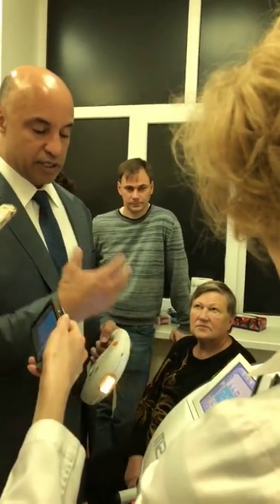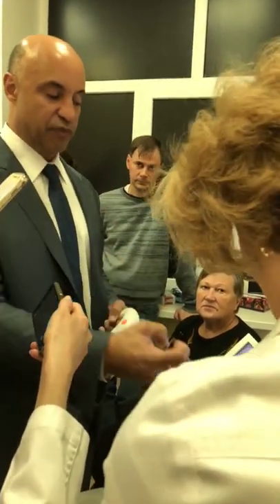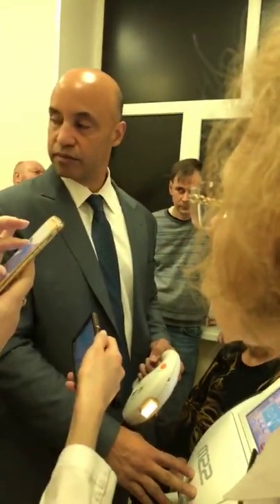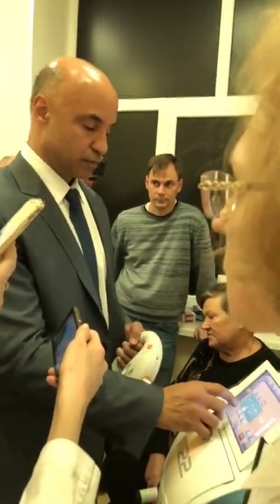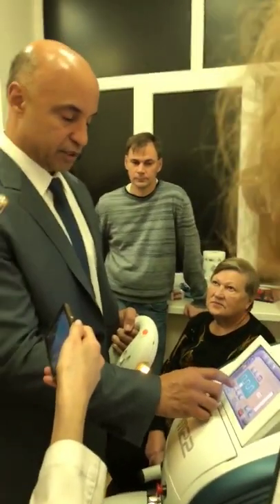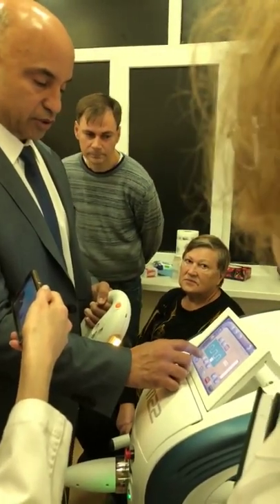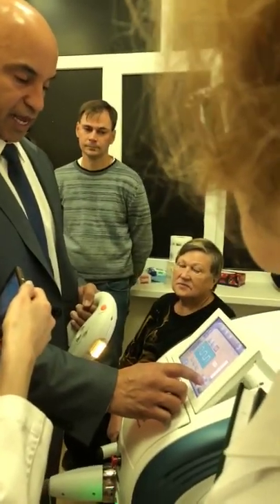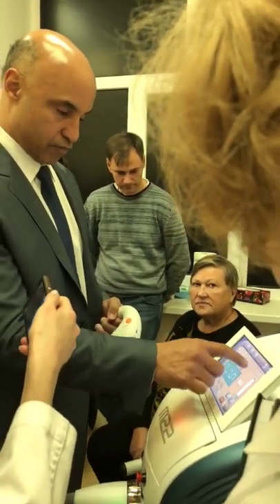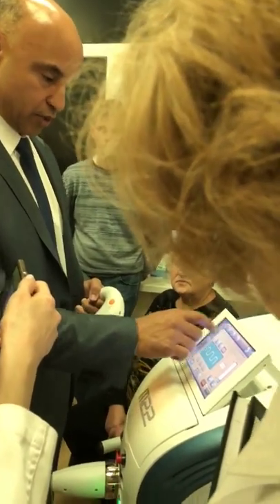So what that allows the skin to absorb that energy and have a little break before you give it another pulse of energy. Ну, надо, чтобы кожа немножко отдохнула, там охладилась, для того, чтобы дадим следующий импульс. But for 95% of the patients, но для большинства, that you're going to be treating, you're going to use these parameters. And then I'm going to set it at 13. Для большинства вот этих параметров, которые 50 миллисекунд, достаточно для охлаждения. And then we're going to go here.